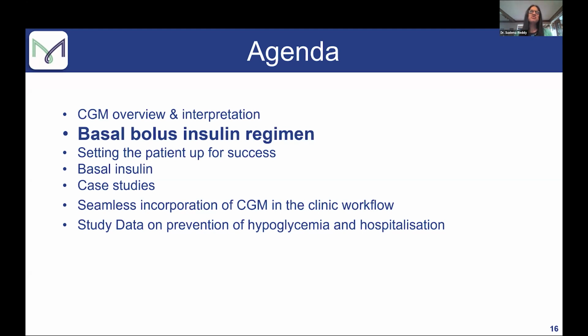And then they can experiment with portion size. They can experiment with physical activity. Like one patient found out a 10-minute walk did nothing to her blood sugar, but 30 minutes helped. So now she goes for 30-minute walks. So by doing this, you help them to make the behavior changes and you find out what is right for them. So the answer to your question is twofold. One is really getting the patient to know what kinds of foods and physical activity affect them. And the second is for medication adjustment. So I believe there's a role for at least a one-time CGM wear. And there is a way you can get it for each of your patients through Abbott. They have a program where you can get one CGM free. Excellent question. Any other questions?